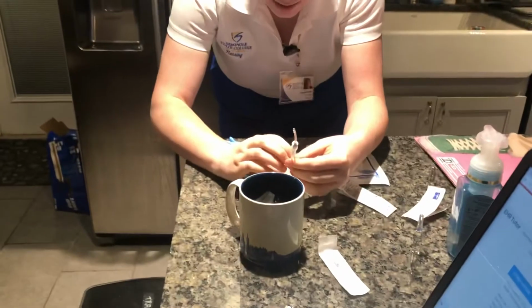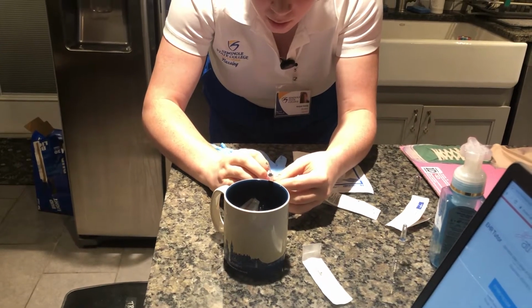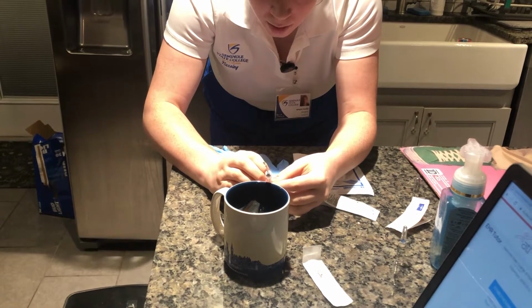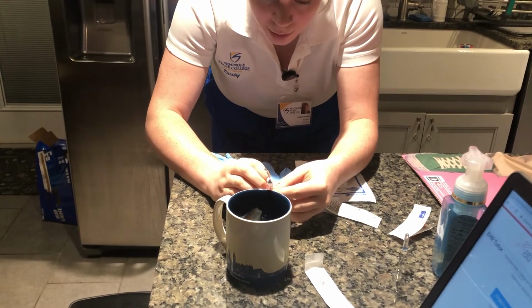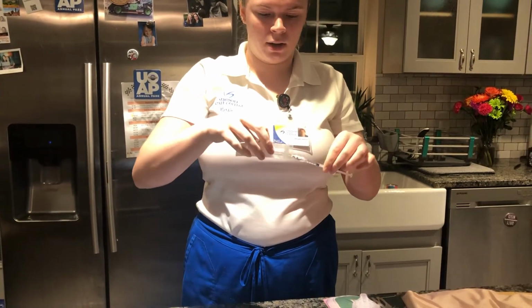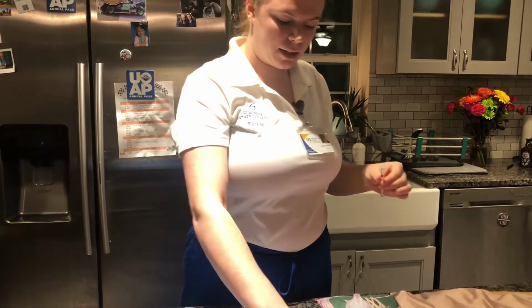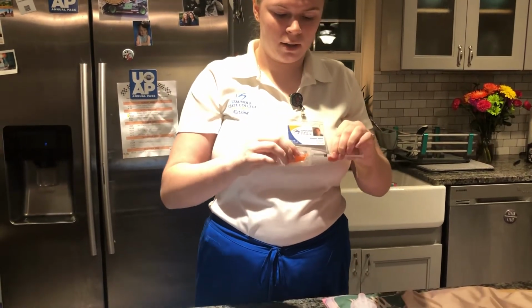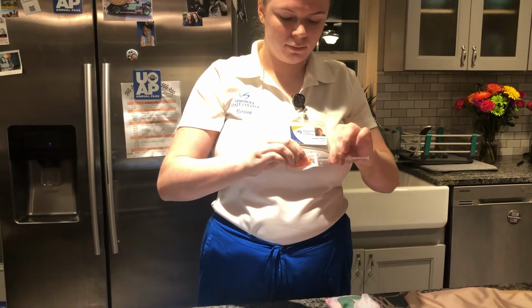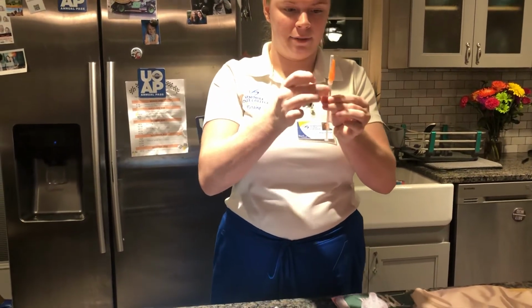We do this in a place where it's designated to get rid of it, but right now I'm just gonna kind of do it over this. We're gonna do it to 0.5. I'm looking at eye level. Again, looking for no bubbles. Okay, and then we're going to remove this filter straw. And then instead we're gonna place on the needle. Again, tapping out anything we need to get rid of.